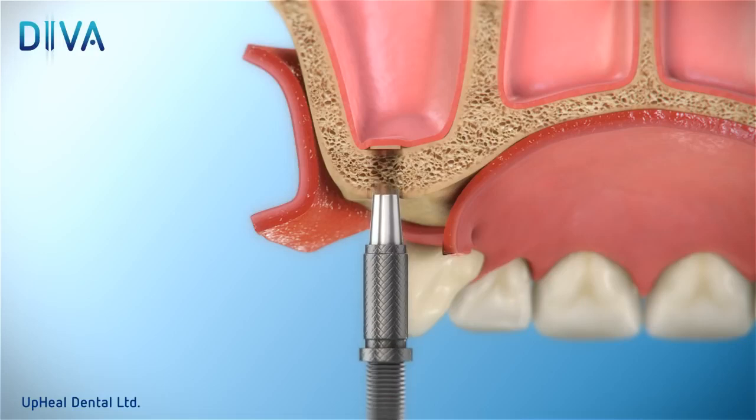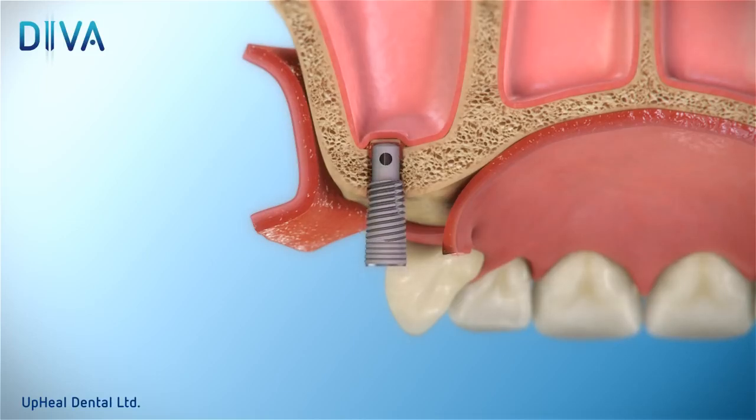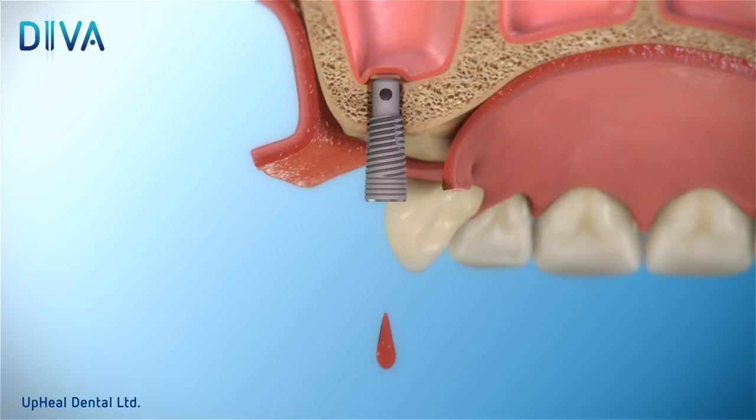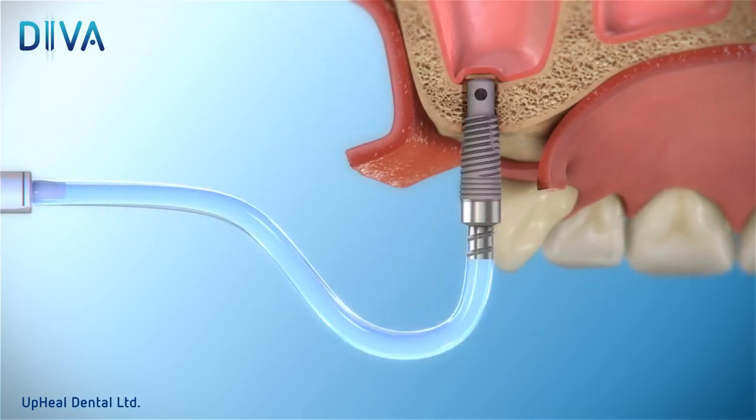Insert and carefully rotate the DIVA device until initial primary stability is achieved. With the attached special driver, unscrew and remove the first valve screw located within the device. The bleeding you observe from the DIVA channel indicates the sinus floor fracture. Now attach the connector to the implant and gently rinse the sinus by introducing 1 cc of saline through the connector.